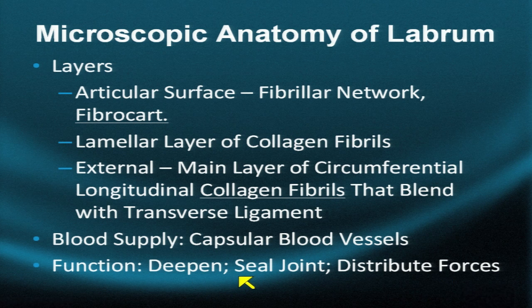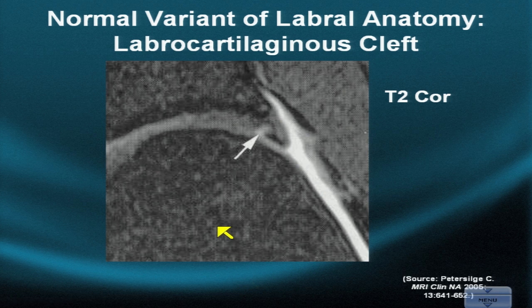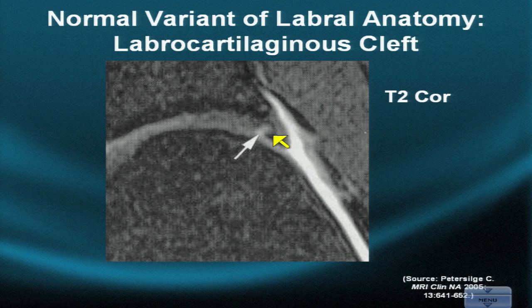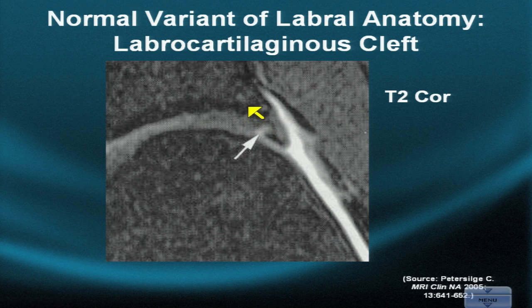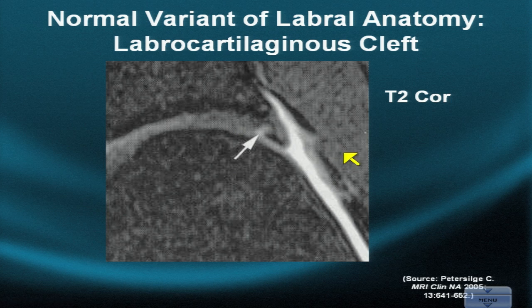The labrum deepens the joint, seals it, and distributes forces in internal and external rotation, abduction, and adduction. A higher-resolution view demonstrates stratification — darker deep, lighter more superficial, more fibrocartilage-like deeper and more collagen-like superficially. The sublabral sulcus is found at the eight o'clock position, just below the anterior equator of the hip in the anterior-inferior quadrant. It appears more smooth and rounded in the coronal projection and more knife-blade-like in the axial projection. The narrow transition between the acetabular labrum and hyaline cartilage is apparent on high-resolution imaging.